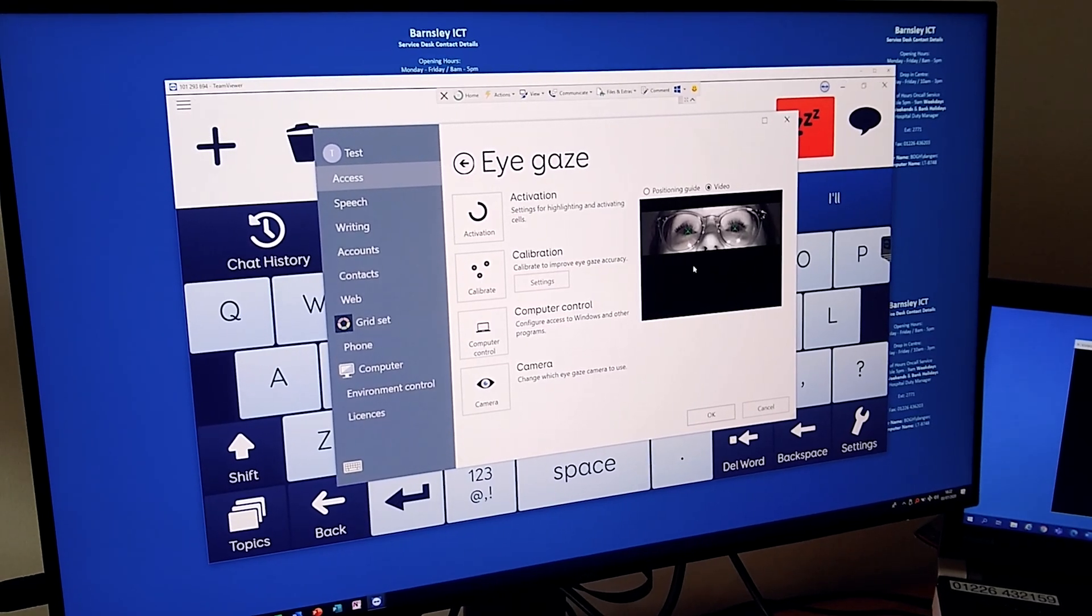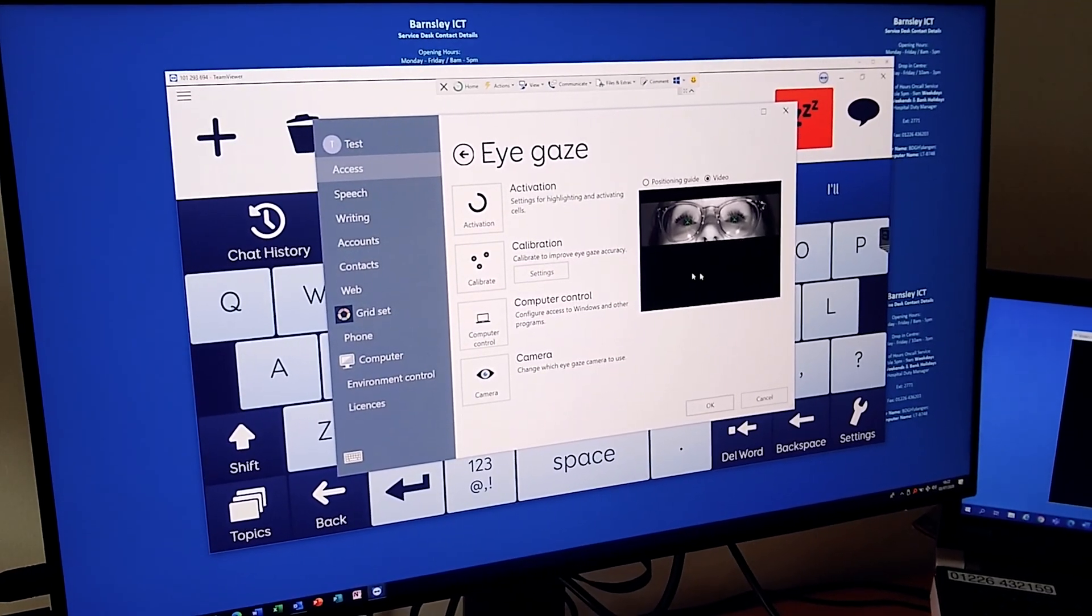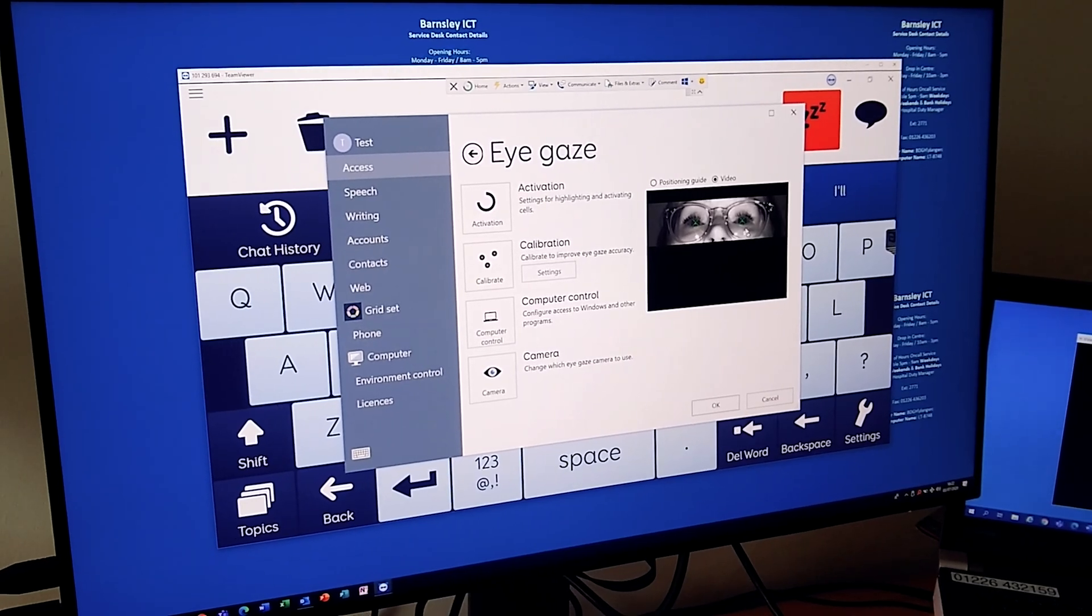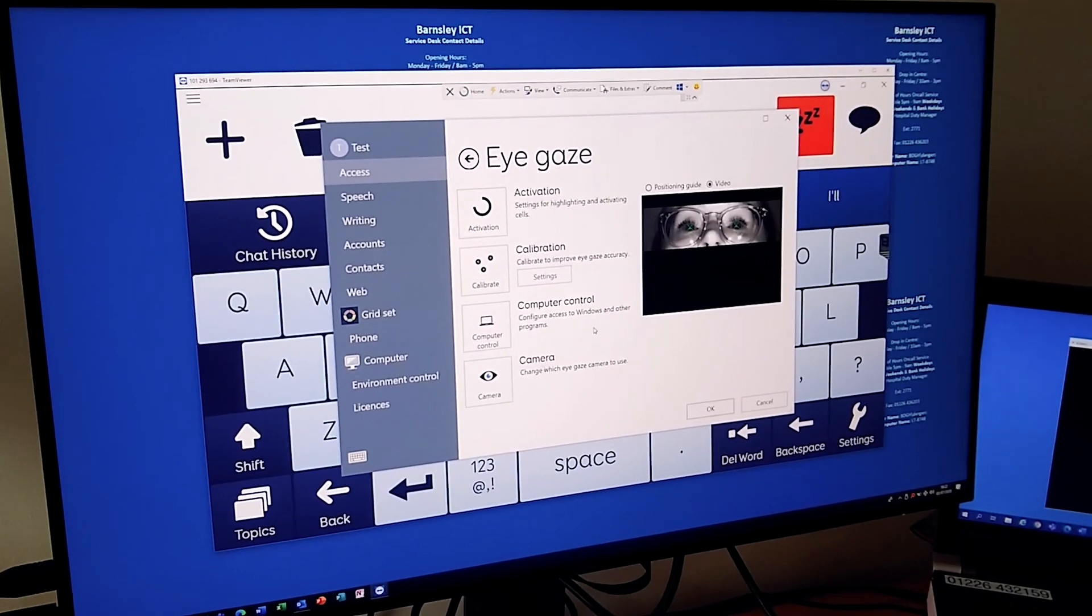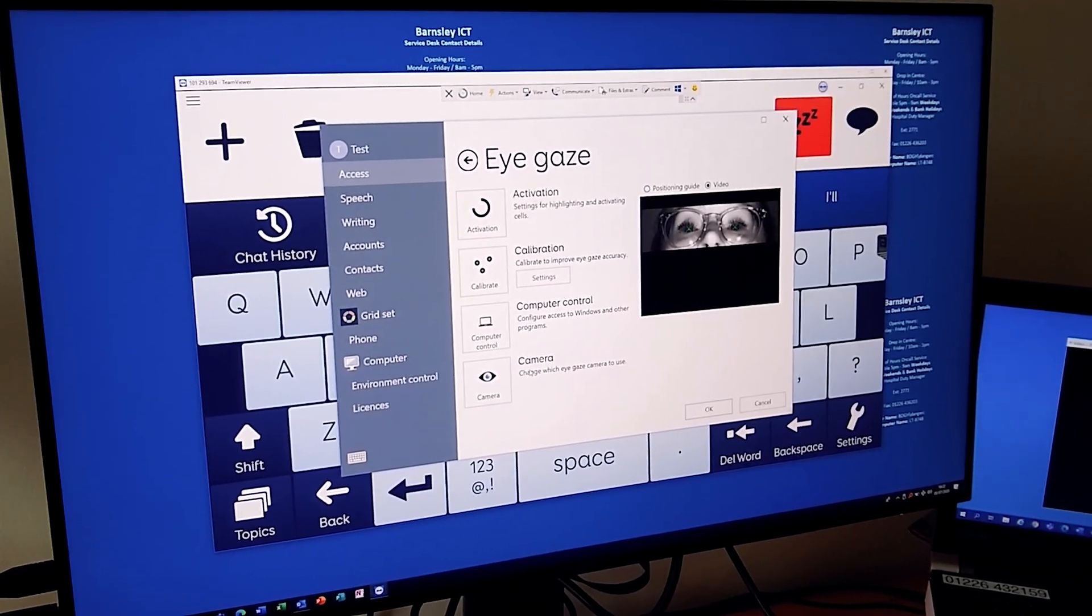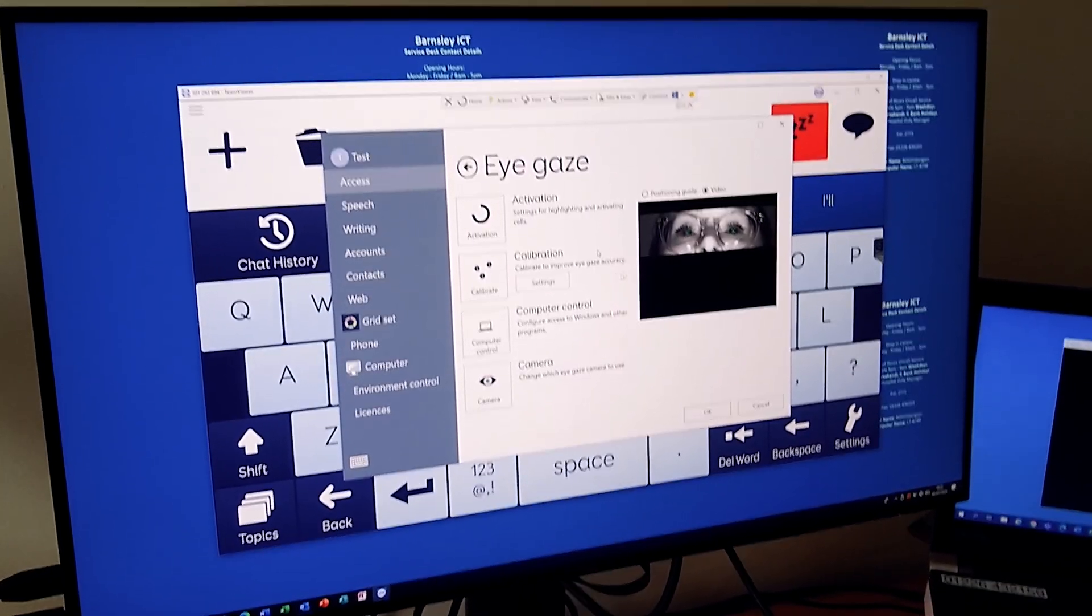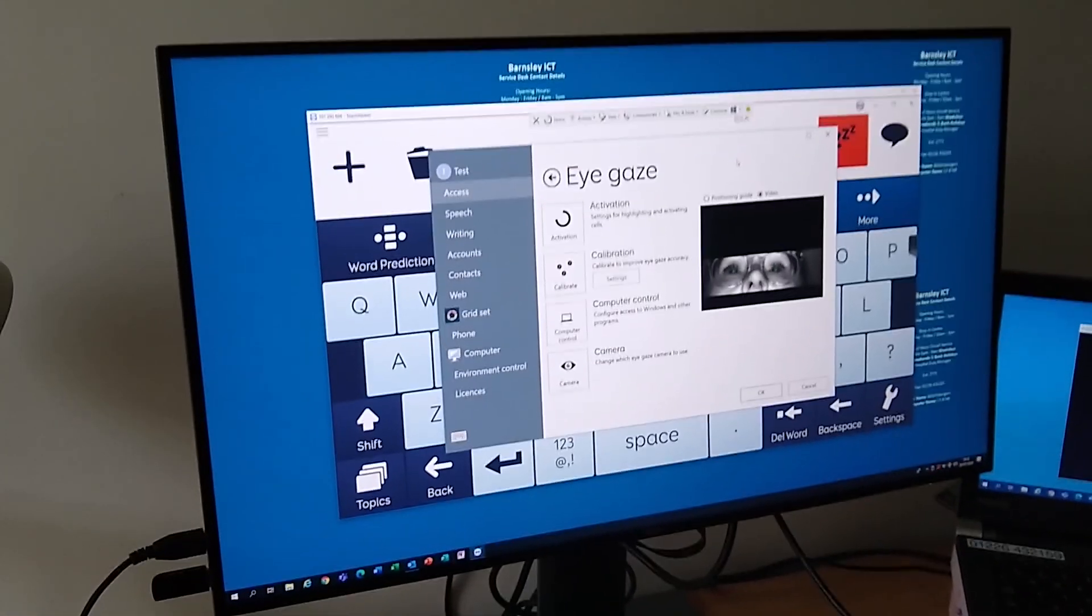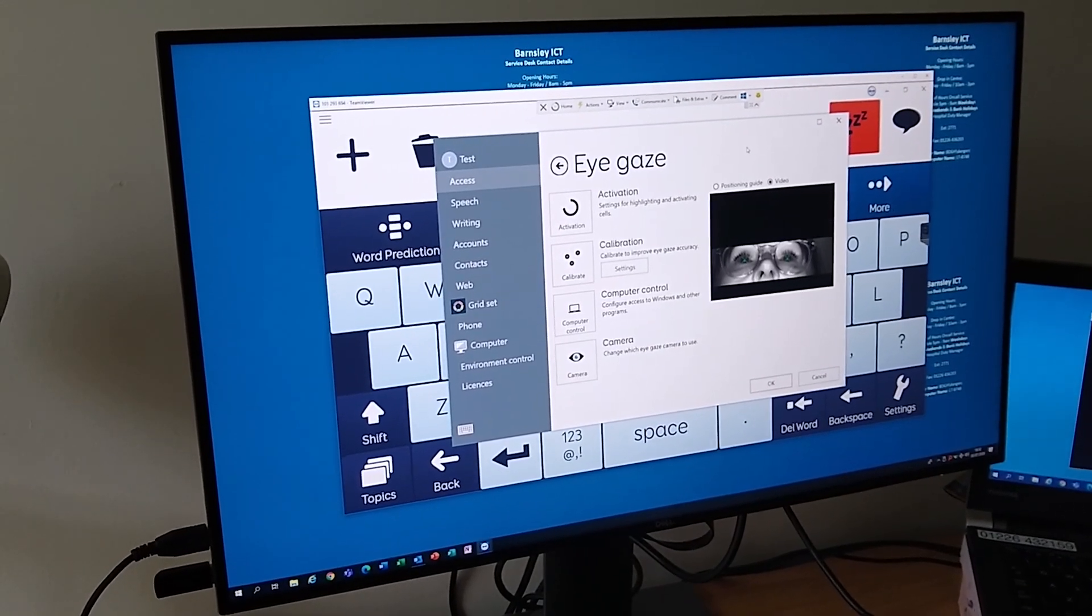I can see that your eyes are both working very well together, so I don't have to make any modifications. It might be that if you had one dominant eye and the other eye wasn't moving the same, we could just use the camera settings down here to just track one eye instead of both eyes, but that's working well.